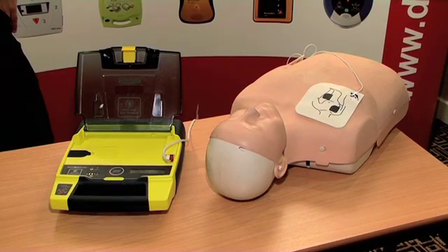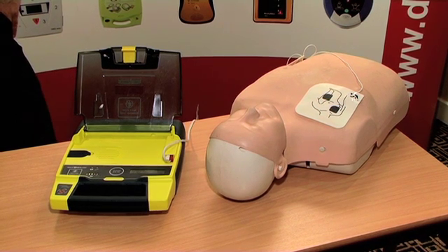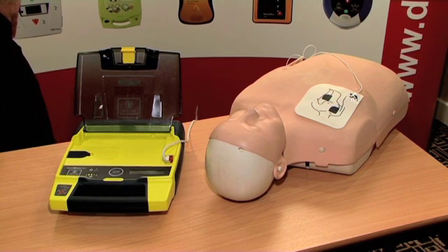Do not touch patient. Analyzing rhythm. Shock advised. Charging. Stand clear. Shock will be delivered in 3, 2, 1. Shock delivered.